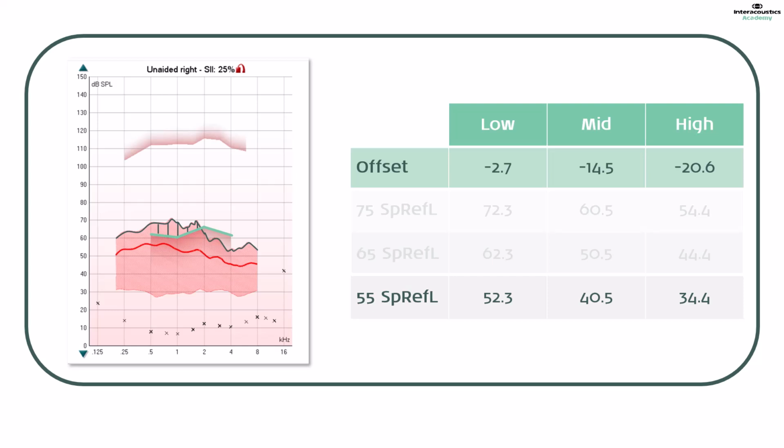It is recommended to refer to the visible speech mapping curves to establish how much of the stimuli are below threshold. If the majority of the stimuli appear to be below threshold, then there is potential value in performing the cortical test, as aided benefit may be demonstrated.